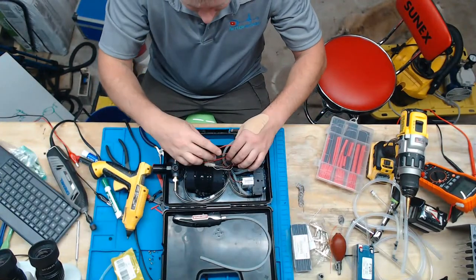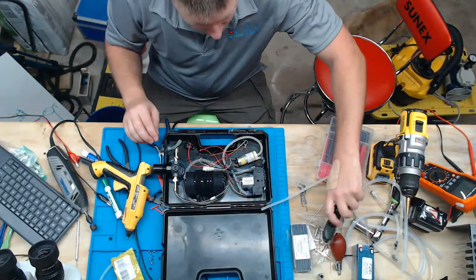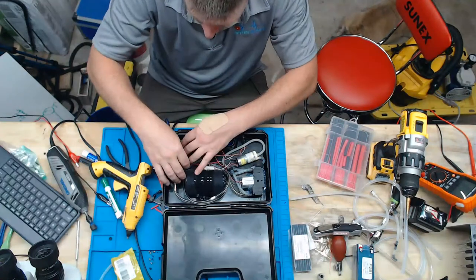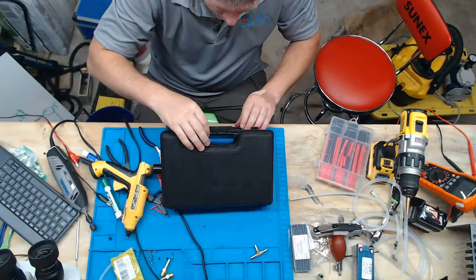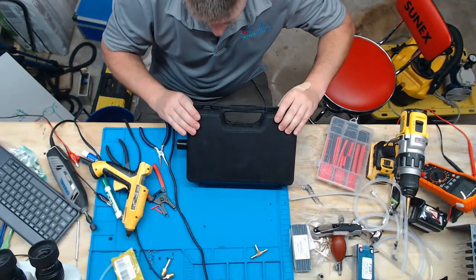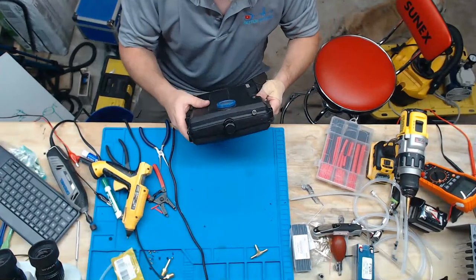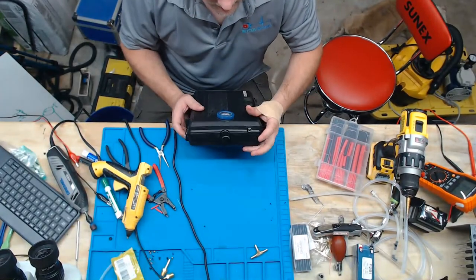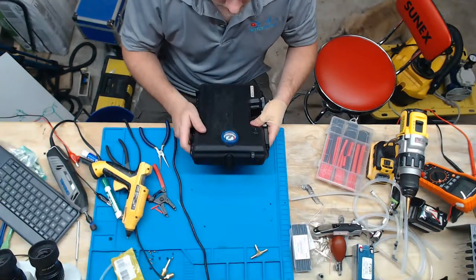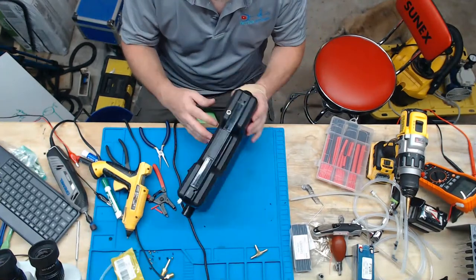All right. So later I will neaten this all up when I know that this is going to be my final design. Let's see. So I put my barrel connector on and now all I need is a male barrel connector. Like that, right? Look at that. All right, so I got my power switch right here. I've got my output test port. I have my regulator right there. And I have an analog gauge. And right here is my power port.